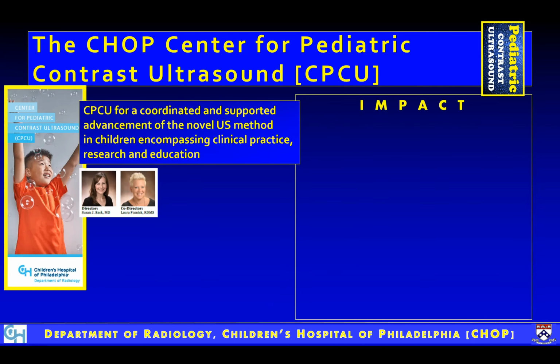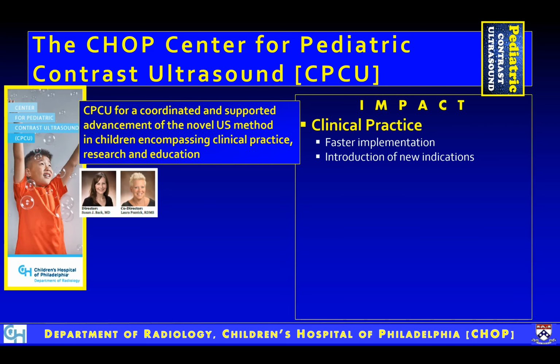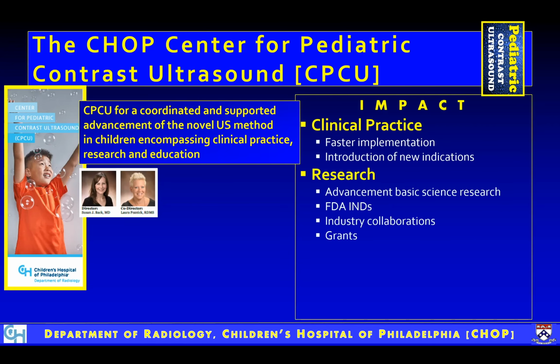The impact has been significant because in the clinical practice, we were able to push the fast implementation, and de facto, we do from head to toe for different indications, contrast ultrasound.